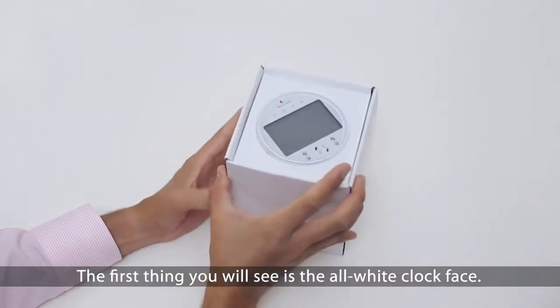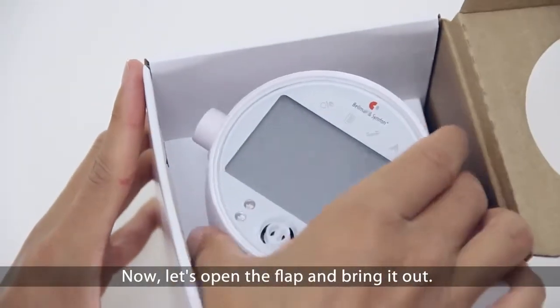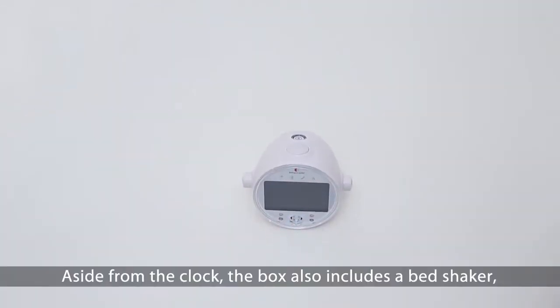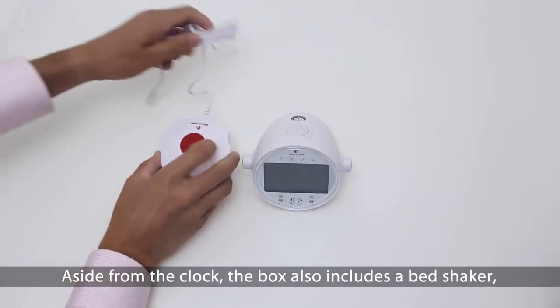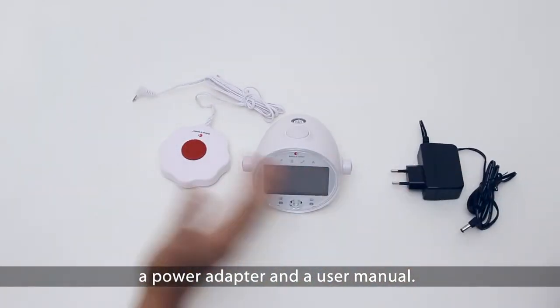The first thing you will see is the all-white clock face. Now let's open up the flap and bring it out. Aside from the clock, the box also includes a bed shaker, a power adapter, and a user manual.